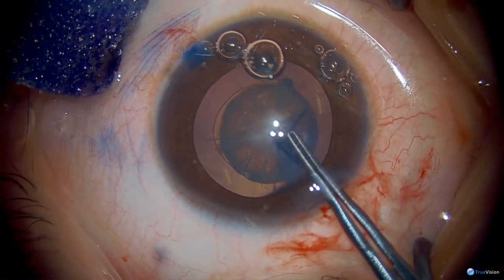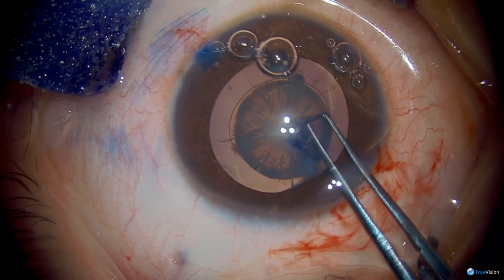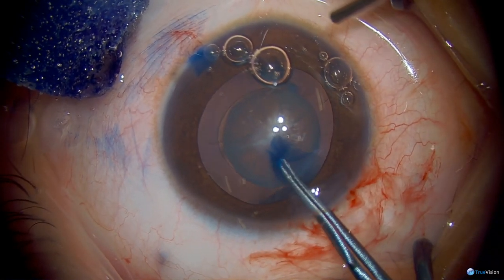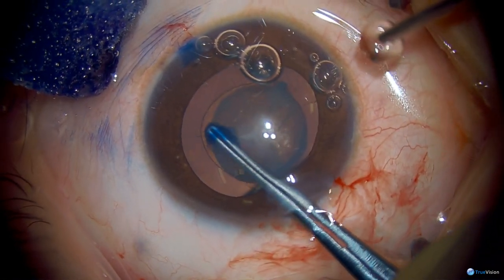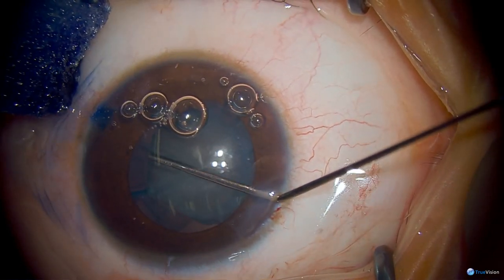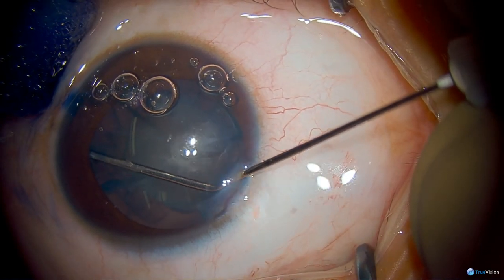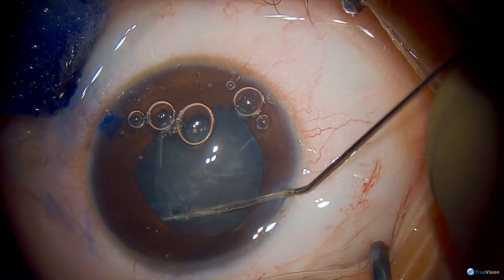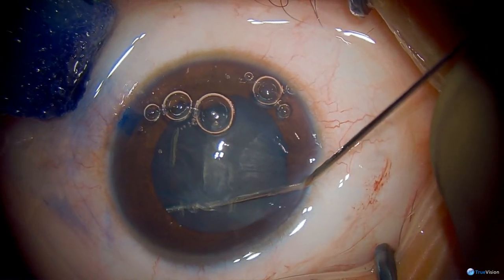Once we've got our anterior capsule completed, since there are no posterior capsule abnormalities in this case, we're performing some hydrodissection. Cortex in younger children is extremely adherent to the capsule, and it's always helpful to have that liberated in multiple quadrants so that you can facilitate the cortical cleanup. Sub-incisional cortex is particularly difficult in children given the adherence of the material.